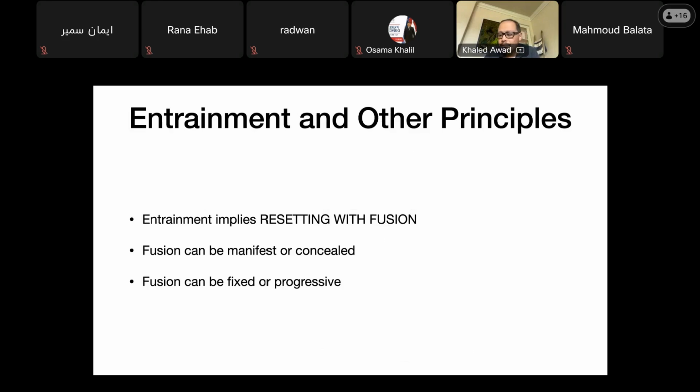Okay. P-wave can be a very dry subject, but actually I think it's a lot of fun, and you need to play with it. And you could play with it in a lot of ways. You don't necessarily have to do a million cases to understand it. While you're in the left atrium, just take your ablation catheter and pace around the mitral annulus, pace around the left atrial appendage, pace on the posterior wall, pace by the right veins, and just look. You don't have to do it in the middle of the case. Just save them. At the end of the case, sit down and try to understand it. And then do it in a lot of patients.